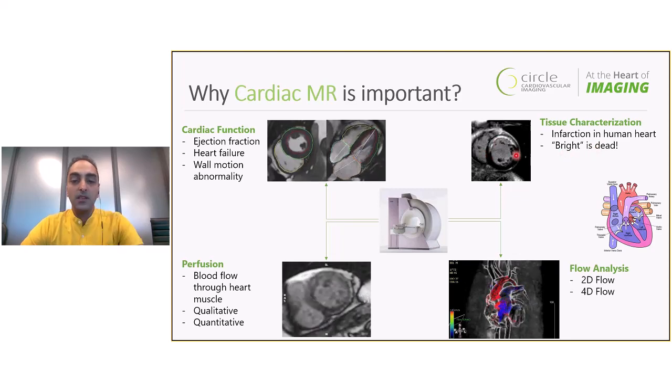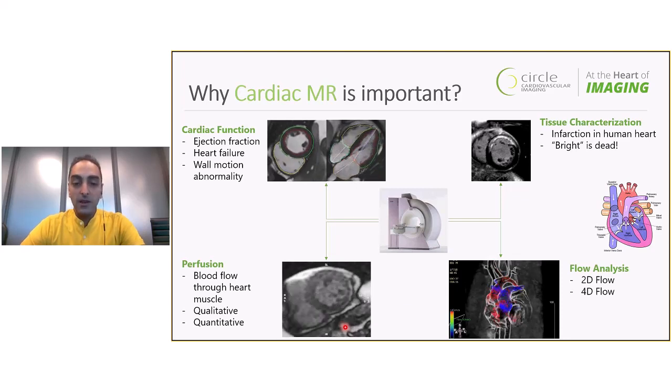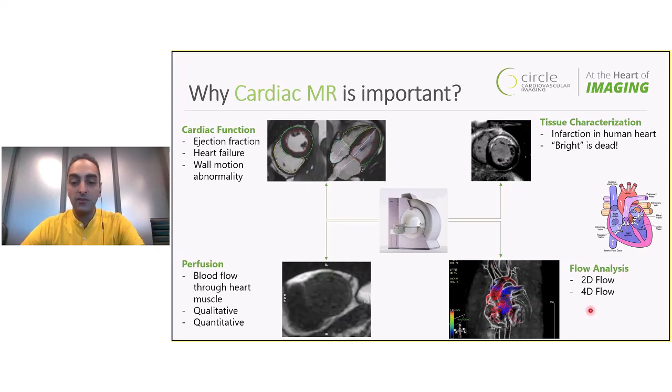And in addition to using static image analysis techniques to look at myocardial infarction, we can actually observe how the musculature around the heart is absorbing these contrast agents as they're being injected, using perfusion imaging to be able to detect if coronary artery disease is actually affecting how the myocardial walls are absorbing blood from the coronary arteries. And finally, we can also use MR imaging to analyze flow in the great vessels of the heart and essentially look to see if there are anomalous patterns in how the blood is flowing through the different vessels.